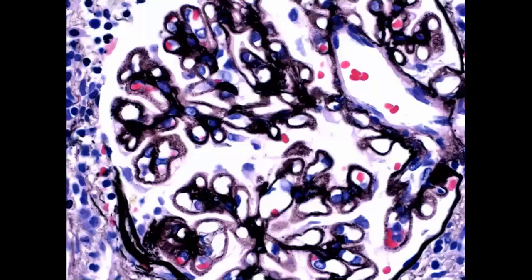So there are subepithelial deposits, maybe with a thickening of the glomerular capillary wall, and on silver stain you see this kind of appearance, a fenestrated, sponge-like or sieve-like appearance of the glomerular capillary loop. What is happening is the dark thing is a remnant of the glomerular basement membrane, and the pale thing there, those are the deposits.